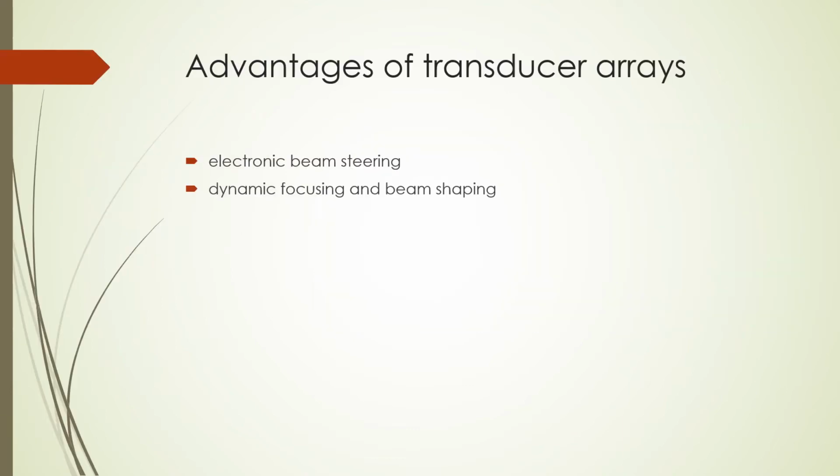So from the preceding slides, we can say that multiple transducer arrays provide several advantages. First, they provide electronic beam steering. Second, they permit dynamic focusing and beam shaping.